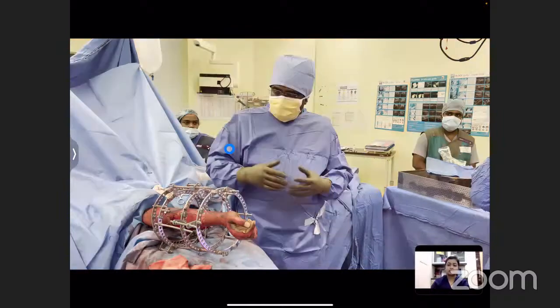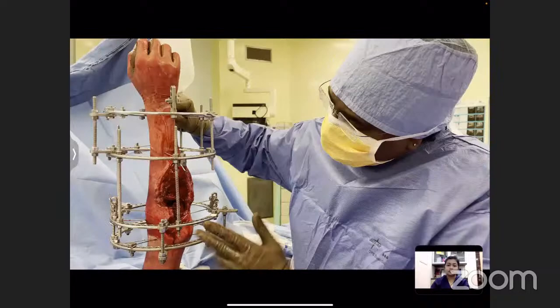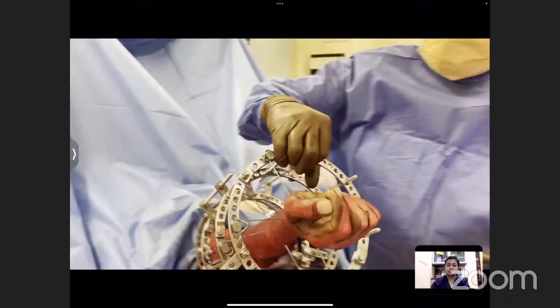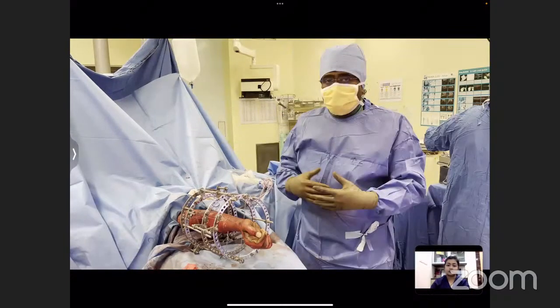Guys, we have finished almost the forearm reconstruction. As you know that they had a blast, and you can see that all thoroughly debrided and merciless debridement. And now we stabilized his elbow, which is dislocated, and fracture also beautifully compressed. And now we are going to put a vac. For the vac, I have not put any rods here. I kept a space for the vac, and it's absolutely beautiful reconstruction. I think he's going to save his limb, and he will do absolutely fine. Thank you.